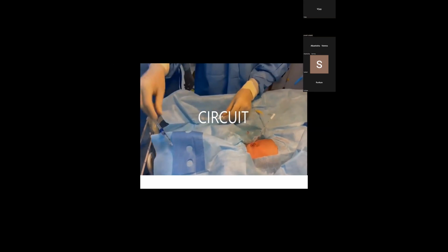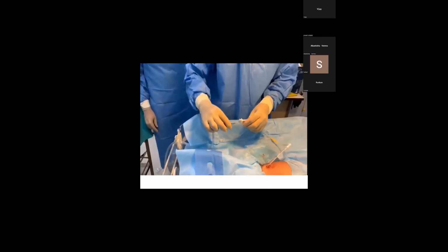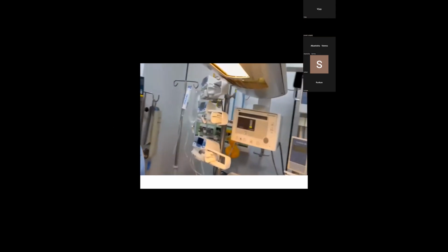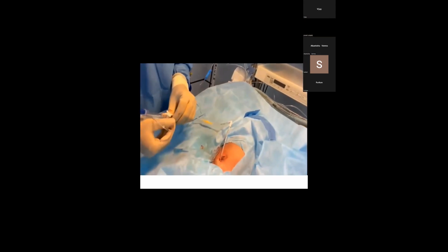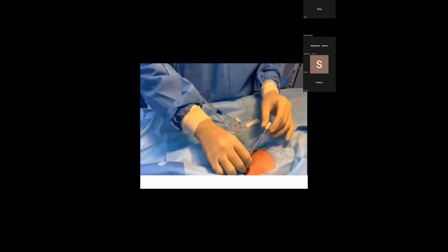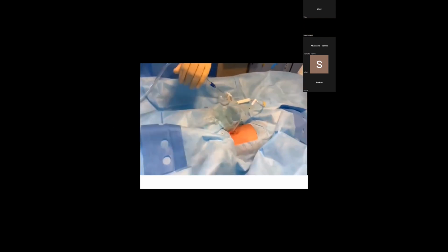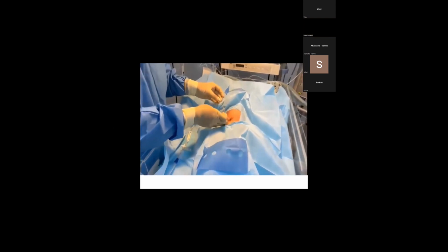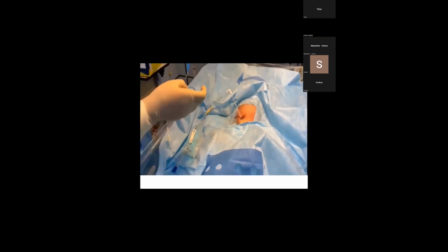After securing the peritoneal dialysis catheter with a suture, we attach the connecting tube, and with the help of the tri-way, we create two circuits: the outflow circuit, which is connected through the drain to the urobag, and the inflow circuit, which is added to the other port of the tri-way. The inflow circuit includes the pediatric burette, through which dialysate is instilled into the peritoneal cavity through the peritoneal dialysis catheter. The outflow circuit consists of the PD catheter, tri-way, and drain to the urobag.